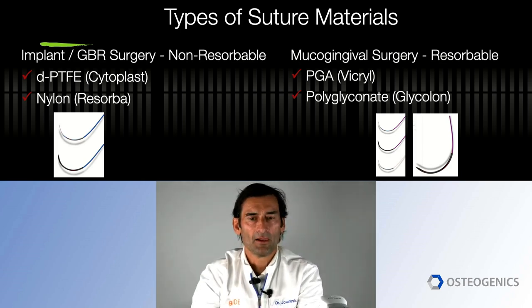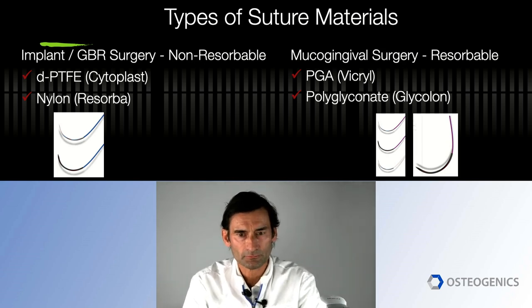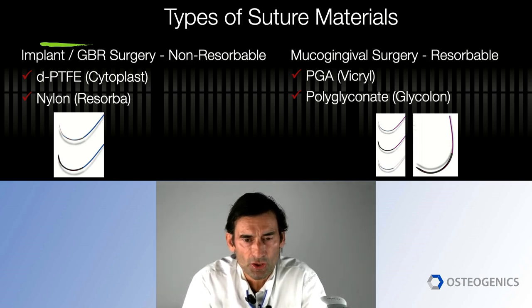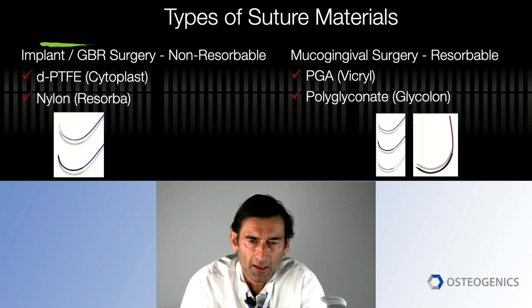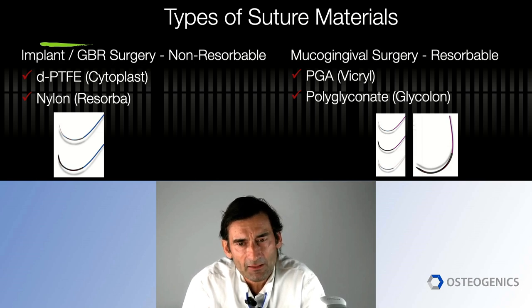Okay, perfect. Now let's talk about the types of sutures. I'm going to go a little bit more technical and see if I can help you go through the jungle which is out there. I've done a couple of posts on social media on Guide Dental, and I think it was also shared with Osteogenics, about suture materials. So this is kind of a repeat of that.